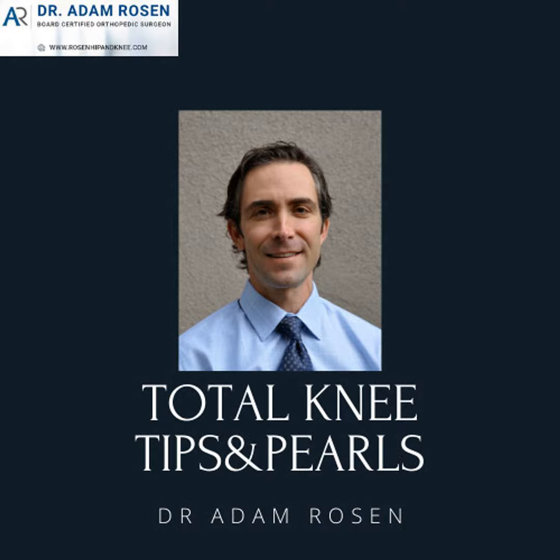The other thing, which I was lucky enough to get trained in with one of my mentors, Dr. Lotke, and you don't really see as much anymore, I think, because of the advent of all of these great titanium sleeves and cones. The things that are available now make these massive reconstructions so much easier. But one of the things that we used to do was impaction grafting, and it really is an art that you have to understand. You have to have the right pore size of the cancellous chips. You really have to impact the hell out of it to make sure that it's impacted down. But we used to use the wire mesh.